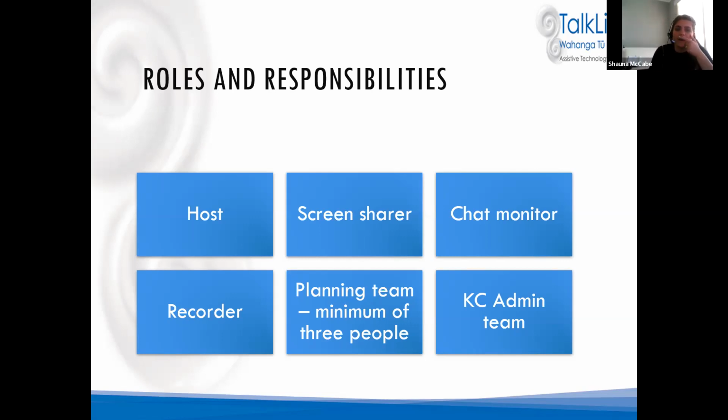Yeah. And the other one that's not on there is we also ask staff members to record themselves using AAC that we then embed into the PowerPoint. So whether that's in the planning team or we have to go and ask other staff members to record themselves using a device around the topic that we're talking about, and then embed it to reduce some of that lag or some of those technical issues that we were having with people, like, you know, not being able to model because there was a glitch or Wi-Fi cut out, or there was a massive lag between audio and visuals. So we did lots of tech working out to figure out how to make the best polished product.